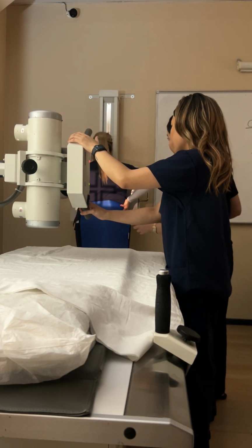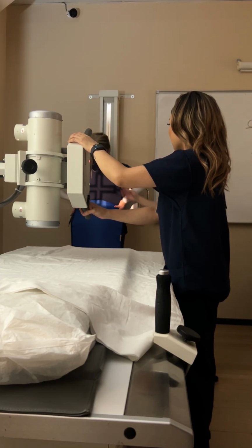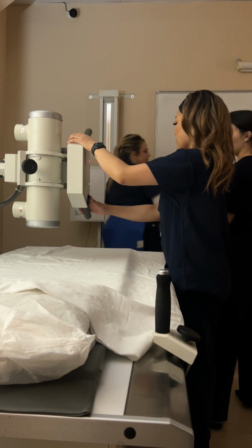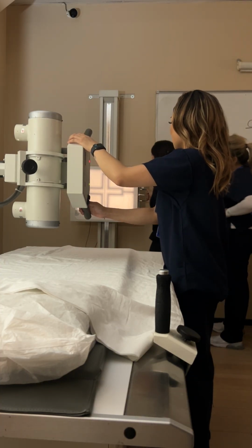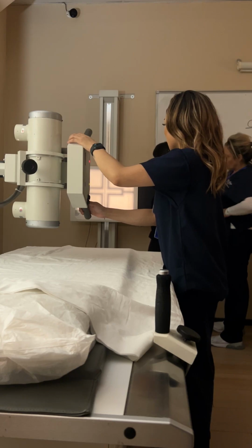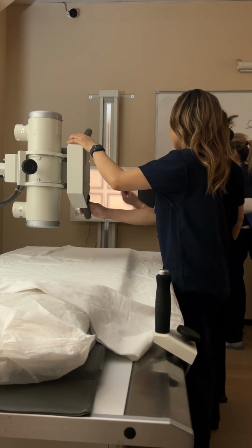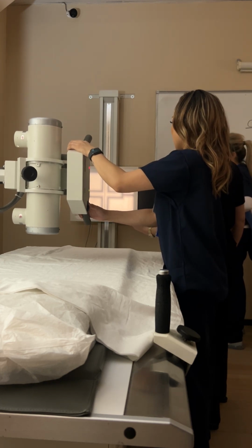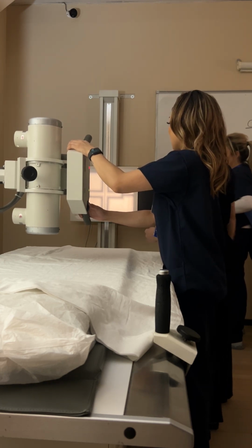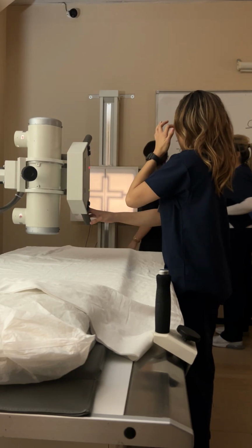The PA though. Can I have you step to the side, over here, so that her left is on my right? And now the L is backwards. So for PA, chest or abdomen, right there we're straight, right? Okay. It is displayed correctly.